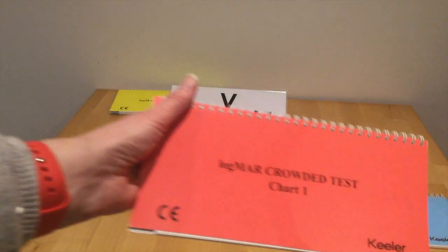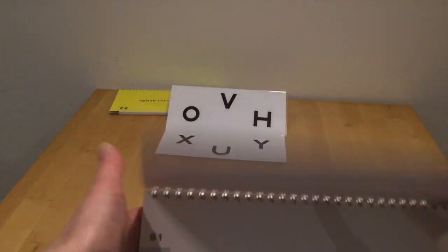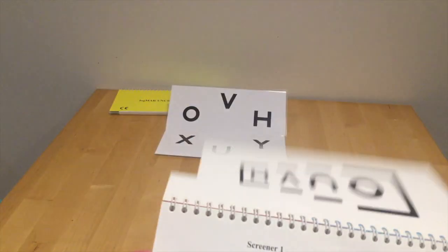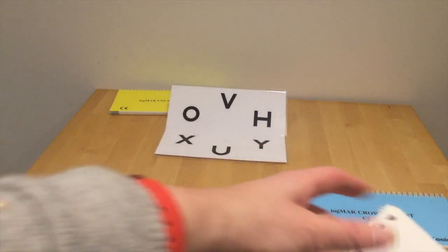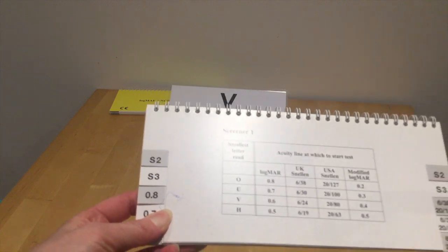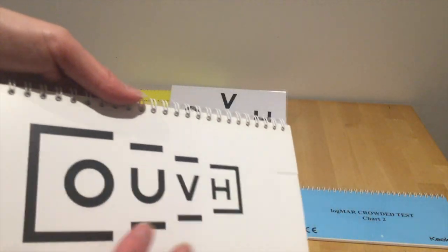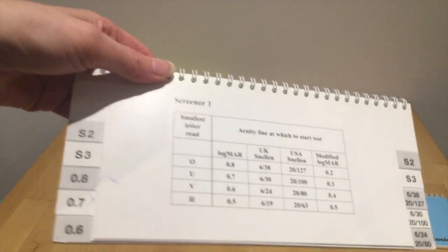Let's take chart 1 now of the crowded test, and I would imagine it's going to be pretty much the same. So we've got screening here at the beginning. So just a very quick test. You can see that the letters get smaller, and you can tell which is the smallest letter read. When I flip back, you'll see that the letters get smaller all along. So if we can read the smallest one, then we've got a logMAR of 0.5.